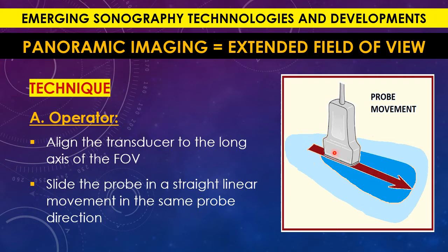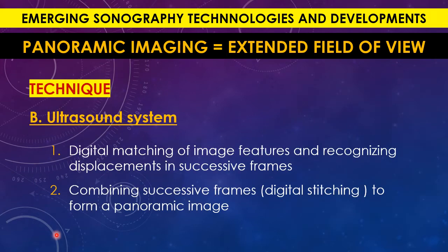The probe should slide over this long axis without rotation, without tilting, without anything, just in the same direction of the probe. So that was the job of the operator. Now what happens in the ultrasound system?